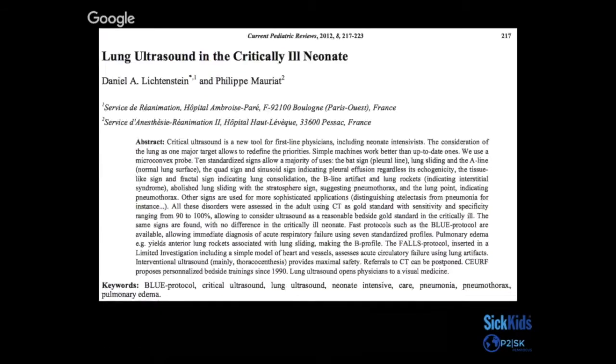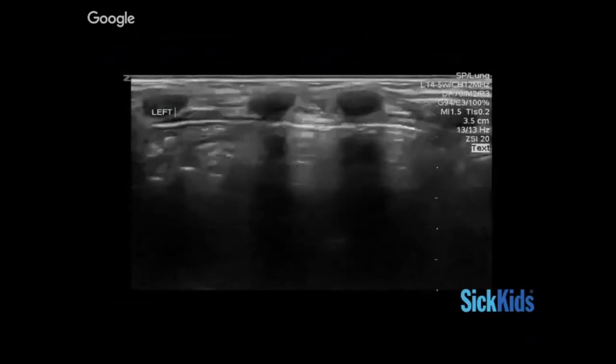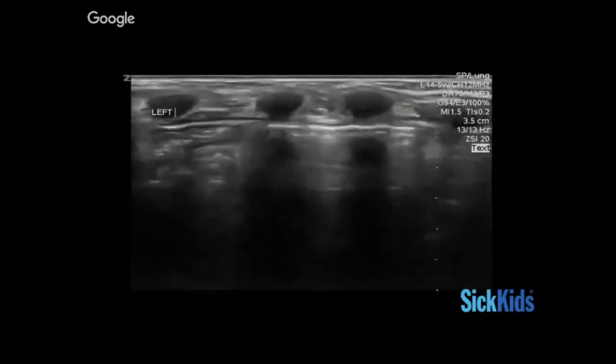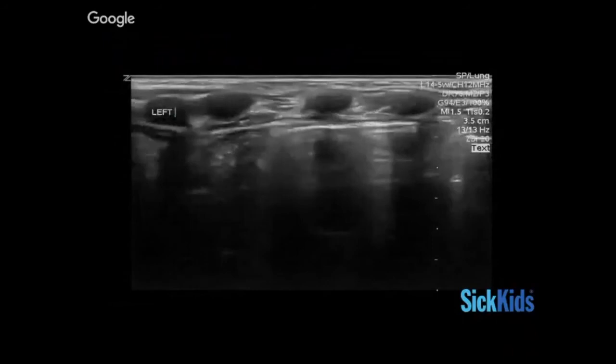Lichtenstein also described this BLUE protocol in the NICU population — the neonatal critically ill. It's a good mental model to consider, but it's not really validated in our PEM population. Here's another good incidental finding picked up by one of our POCUS faculty, Cherise Kwon. What do you guys think? There are some bowel loops in the lungs — this is a patient with congenital diaphragmatic hernia where you see these abnormal bowel loops within the thorax.